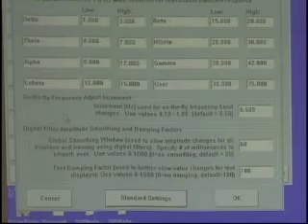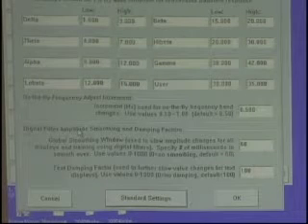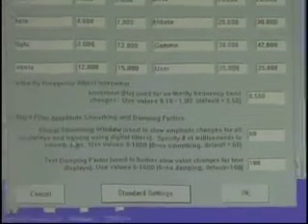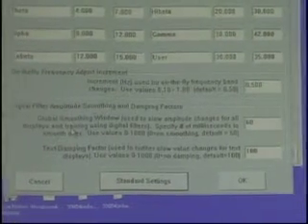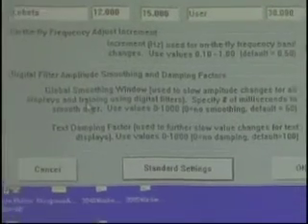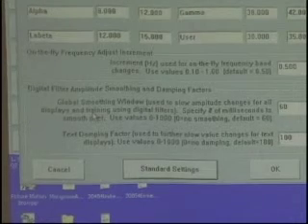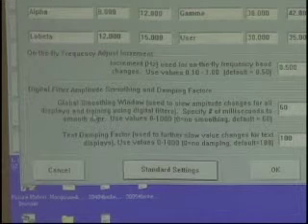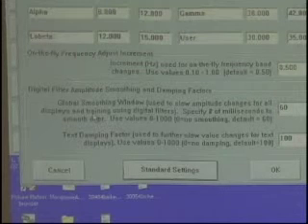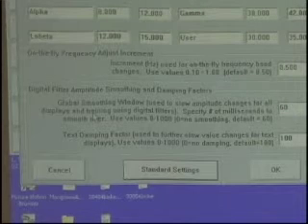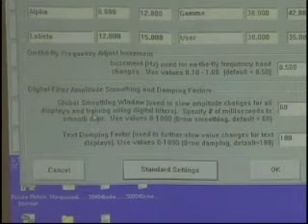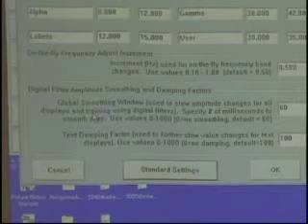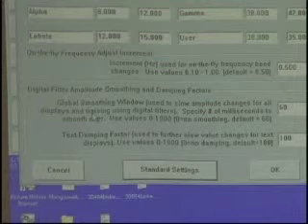Digital filter amplitude smoothing and damping factors. Looking at the thermometer screen on the training screen — the little thermometer panel — if it's bouncing up and down too fast and it's too jumpy, you want it to be smoother and more aesthetically pleasing. You can do that, but there are pros and cons. You can slow down the thermometer and make it smooth, but you've introduced delay.